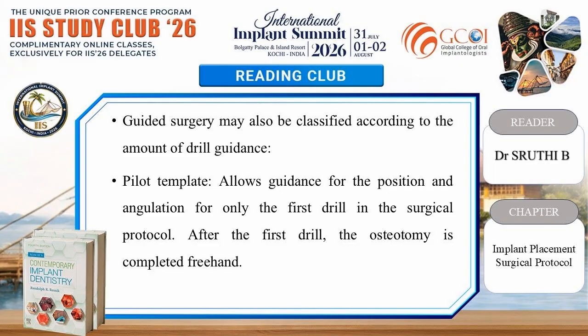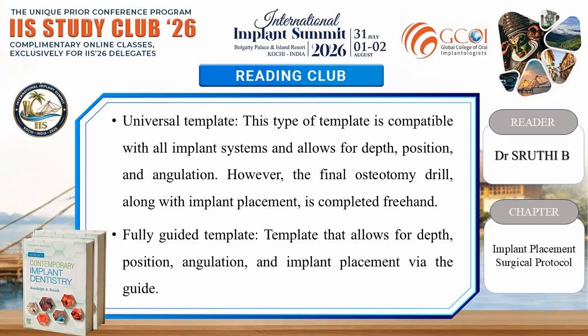Pilot template allows guidance for the position and angulation for only the first drill in the surgical protocol. After the first drill, the osteotomy is completely freehand. Universal template. This type of template is compatible with all implant systems and allows for depth, position and angulation. However, the final osteotomy drill along with the implant placement is completely freehand. Fully guided template. Template that allows for depth, position, angulation and implant placement via the guide.